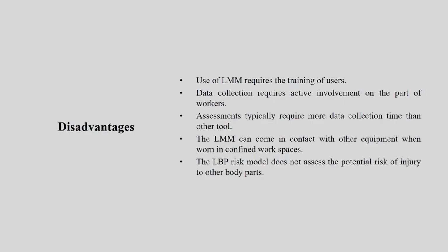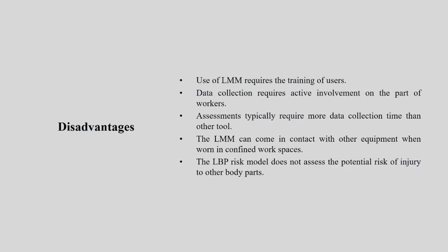But there are some disadvantages. For every tool there will be some advantages, there will be some disadvantages. Based on your objective, you have to choose which one is useful for you, which one is not useful for you. So use of LMM requires training. You can understand it's a complicated instrument. It needs understanding about the software, it needs understanding about the hardware, it needs understanding of how you integrate them. So it needs a lot of training.